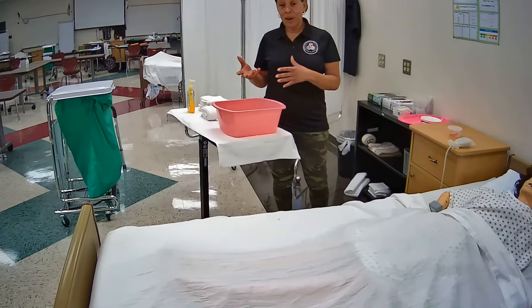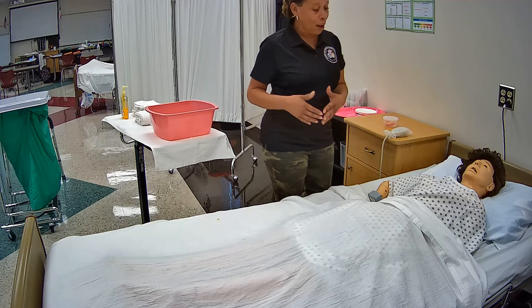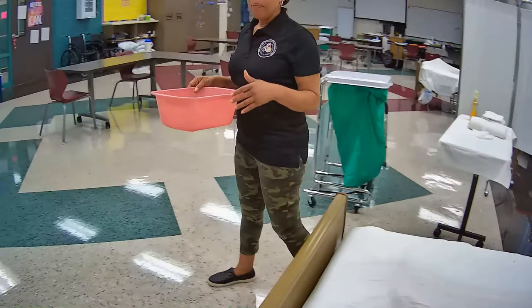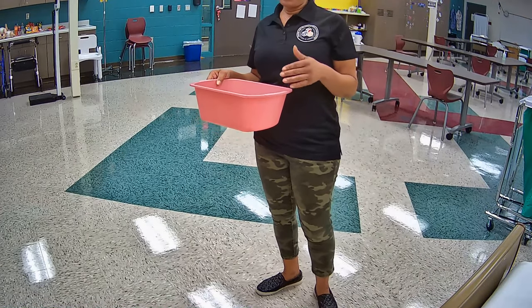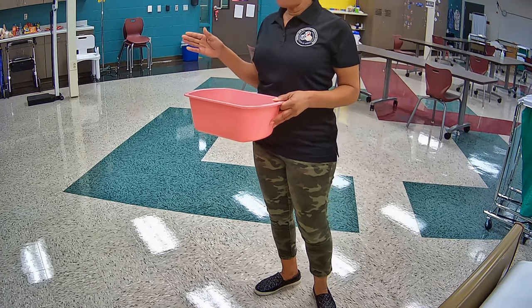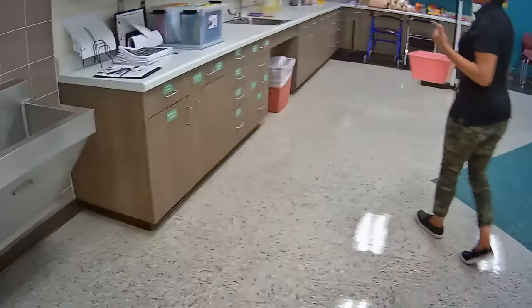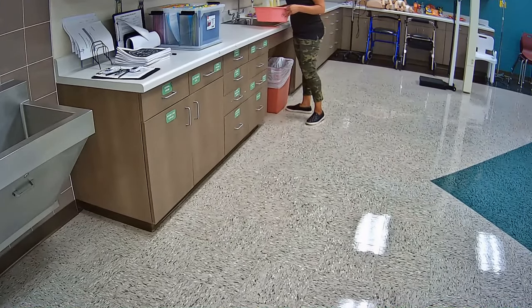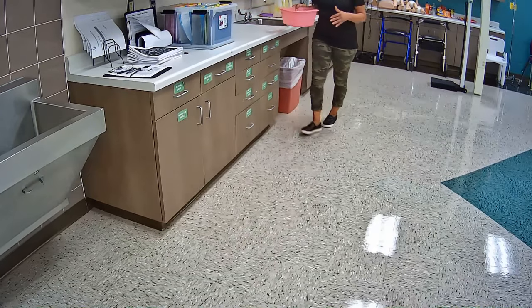The next thing I'm going to do, after I've collected my supplies, is knock on the door again. Hi Mrs. Jones, it's me Julie, your CNA. I've collected all my supplies. Now I'm going to go fill the basin with water. When I fill the basin, I'm not going to fill it completely — only a small amount because I do not want the basin to be heavy. You also have to test the water first before you allow the resident to test it. Make sure you verbalize it; verbalize everything you do before you do it. So I'm turning on the water, testing the water, and filling the basin — not putting a lot in because I do not want it to be top-heavy.